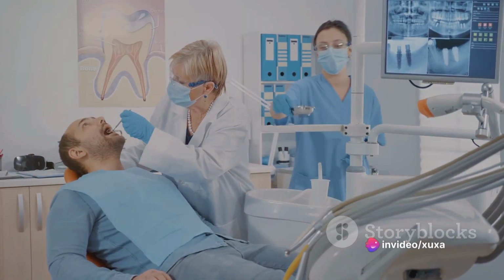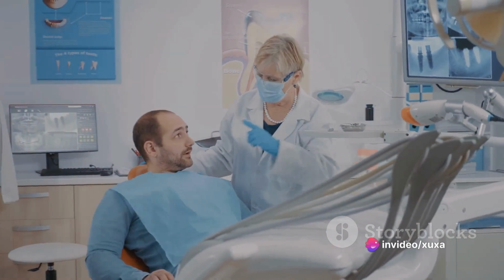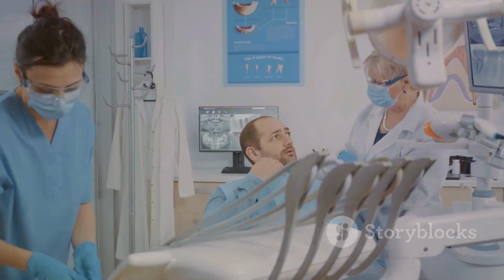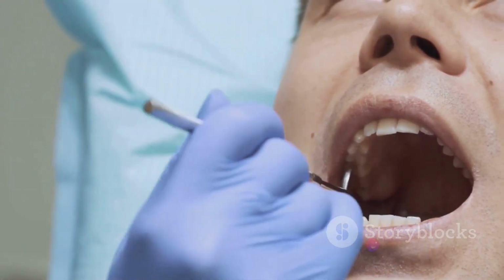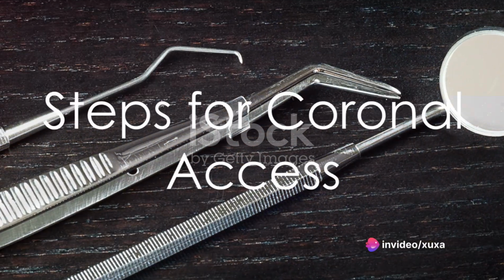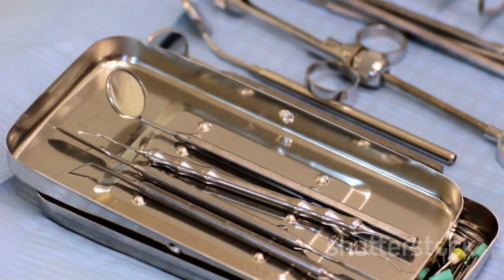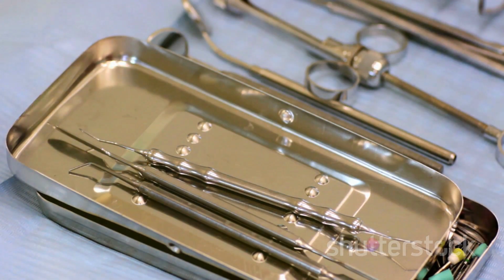Before the coronal access, several prerequisites must be met. Check the tooth and root inclination in the dental arch, remove any decayed dentin or restorations that may hinder access, smooth sharp surfaces to facilitate absolute isolation, and remove any inclined planes of the crown that could interfere with external references. The operational steps to access the pulp chamber include establishing the preferred area and initial contour shape, removing the remaining roof wall, and preparing the side walls.